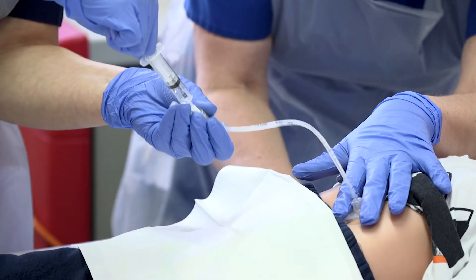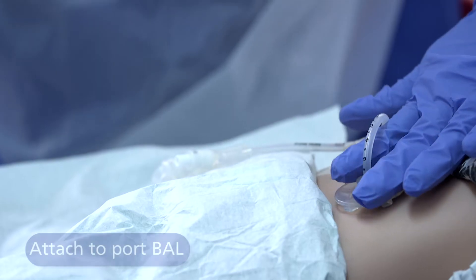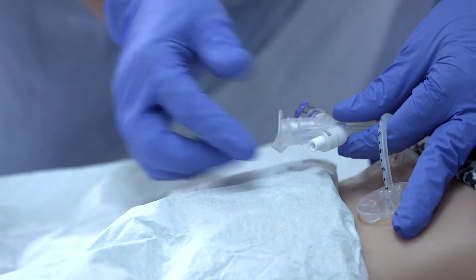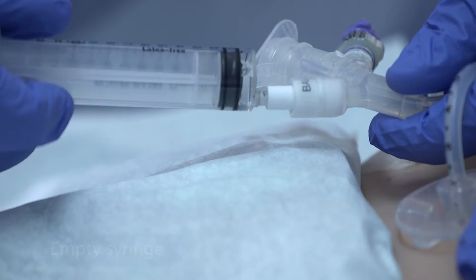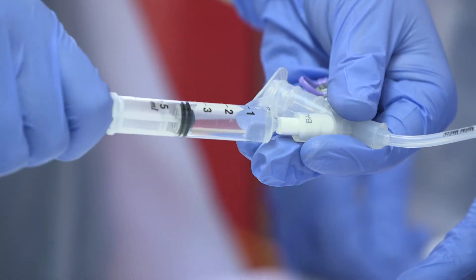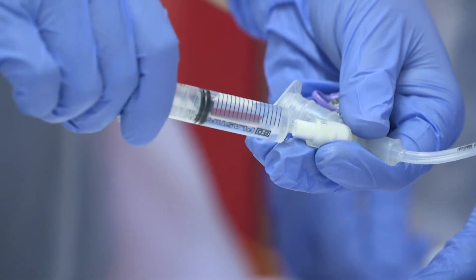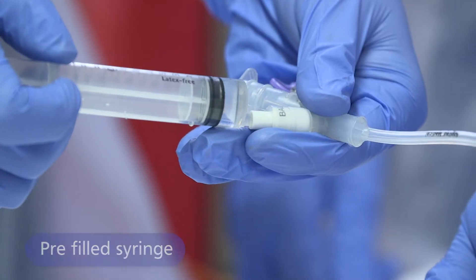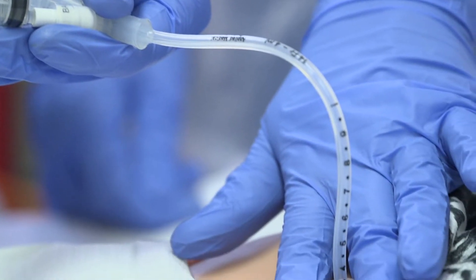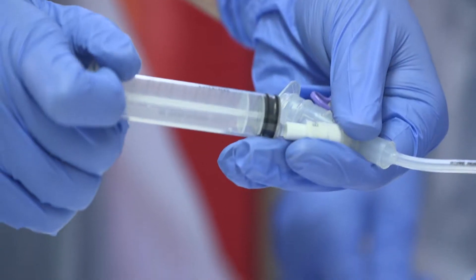One person will hold the tube in place to stop it from popping out and the other will change the water. Holding the tube in place, connect the empty syringe to the white port labelled BAL. Gently pull back to withdraw the water and make sure all the water is removed. You may feel resistance when the balloon is empty. Check the amount of water withdrawn to confirm it has been removed. Then connect the pre-filled syringe and gently push the plunger down, pushing the water into the balloon. Apply pressure on the plunger to prevent the water coming back out and disconnect.